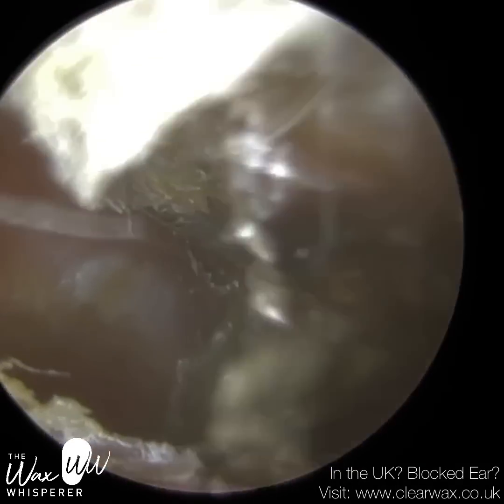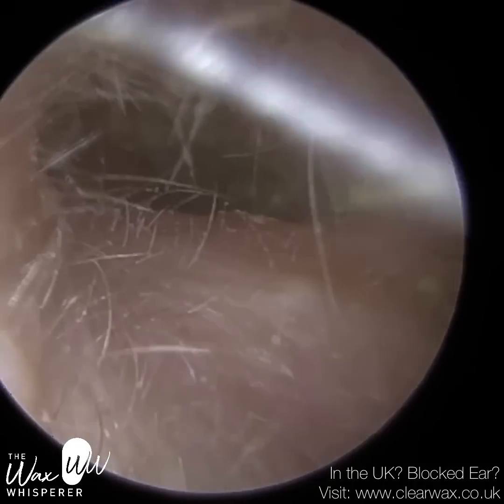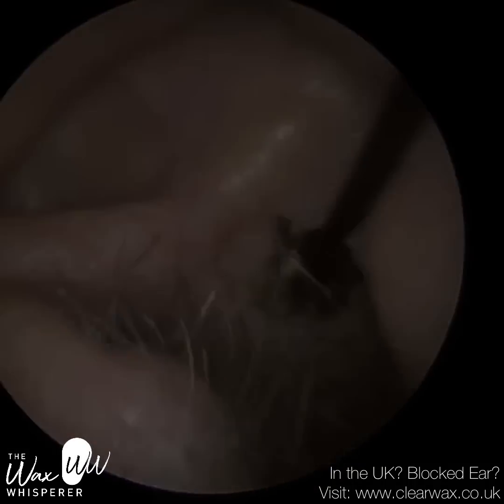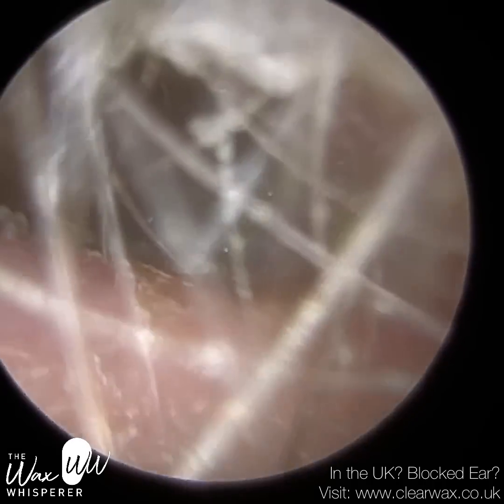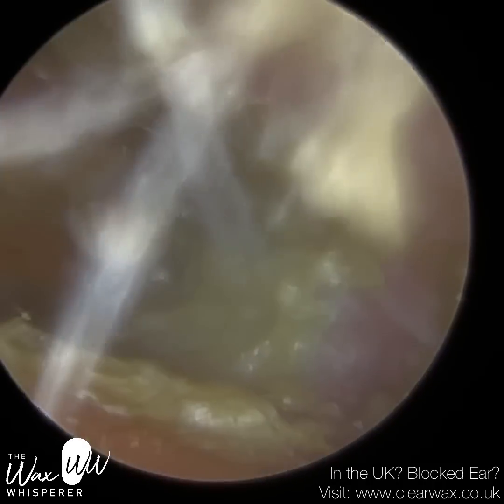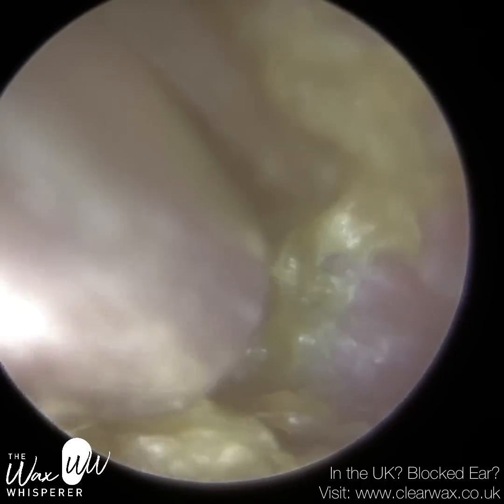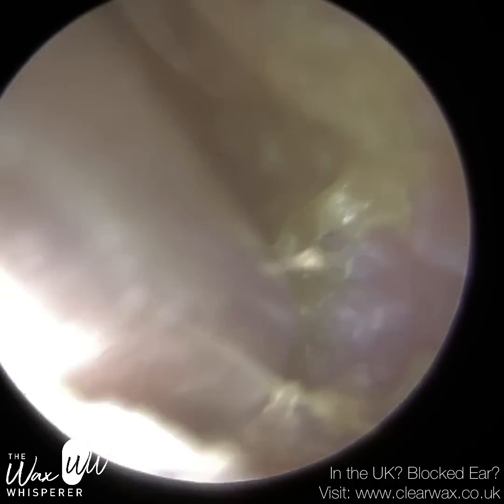Slowly but surely, I'm just extracting the hook out of the ear, and as I am, this plug is also being removed. That was the main occluding blockage that we've cleared. You can see the eardrum there, and you can see this softer, wet discharge and dead skin at the floor, at the base of the ear canal.